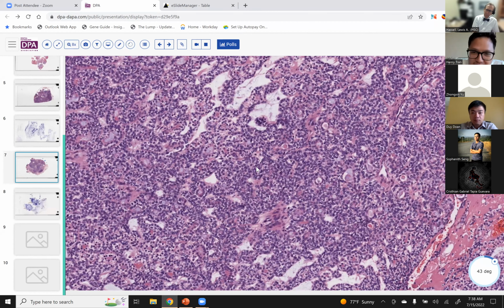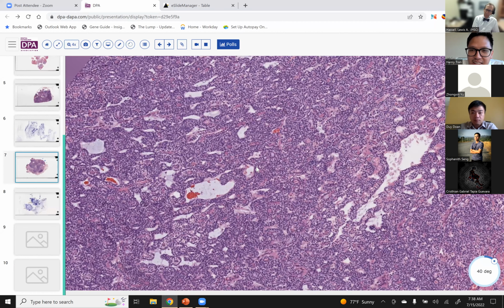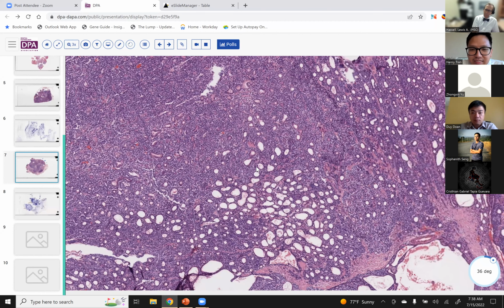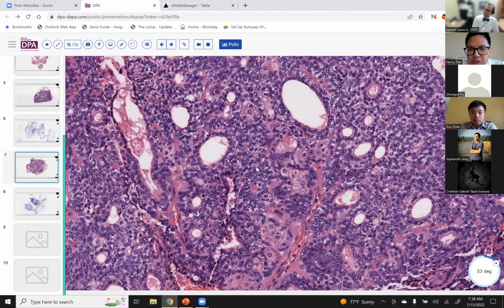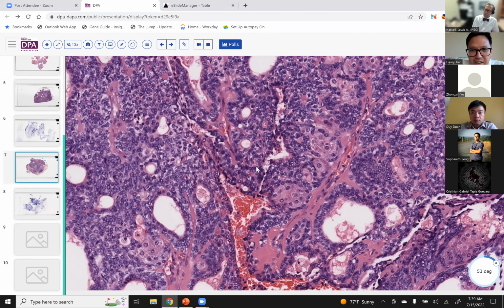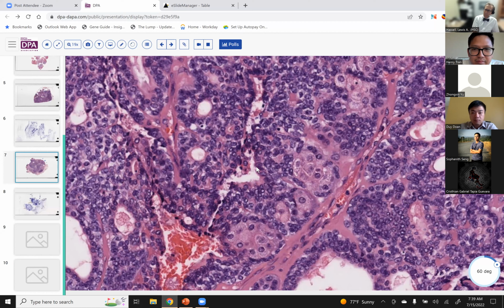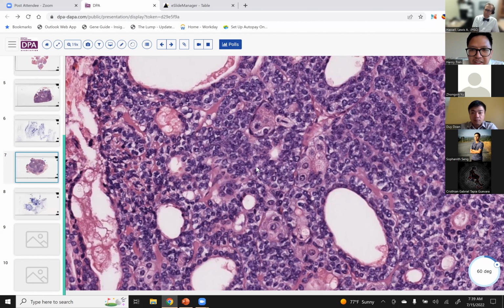And I'll be honest, I don't really see a lot of salivary gland tumors, and the actual way that I figured out this diagnosis is because of another area here. So again, we have a lot of these myoepithelial type structures, and within some of these areas, we see these large epithelial cells that are interspersed throughout. So here's a good example.